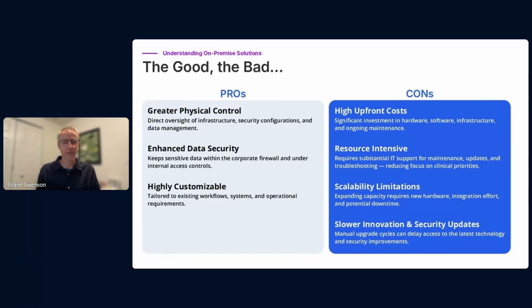And typically with this type of deployment solution, the rate of change is slow, meaning you have something that's validated and it's working. You don't really want to make an update to it next week if you just validated it last week. And so this tends to mean that both innovation and security updates are delayed and maybe taken on a quarterly to annual update cycle, as opposed to maybe a more frequent cycle that would be preferable.